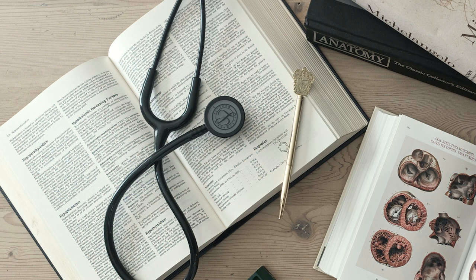Right, with VPCs, the general rule, the key identifier, is that there is no abnormal P wave preceding the premature ventricular complex. You might see a normal sinus P wave buried somewhere near it or in it, but there's no early P wave triggering it. This is your immediate red flag that the abnormality originates directly in the ventricles themselves. No early P wave, origin is ventricular.